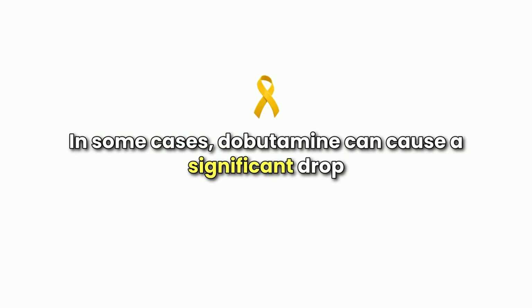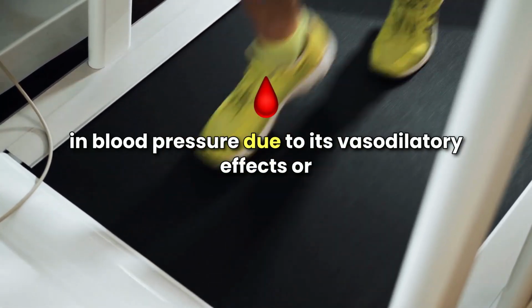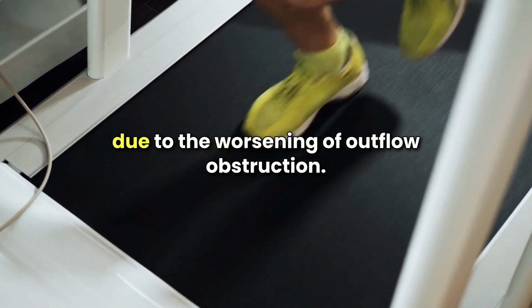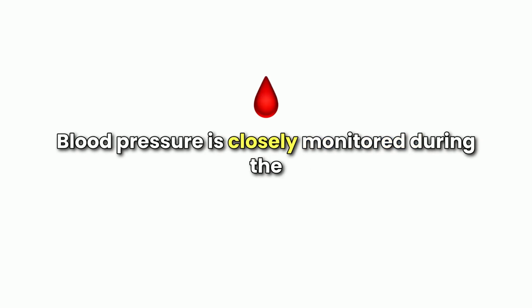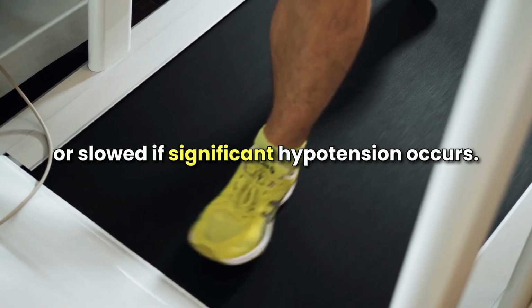Hypotension is another risk. In some cases, dobutamine can cause a significant drop in blood pressure due to its vasodilatory effects or due to the worsening of outflow obstruction in severe aortic stenosis. Patients may experience dizziness, lightheadedness, or fainting. Blood pressure is closely monitored during the test, and the infusion can be stopped or slowed if significant hypotension occurs.